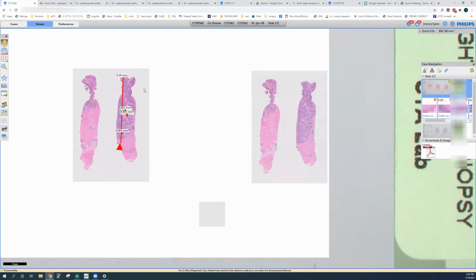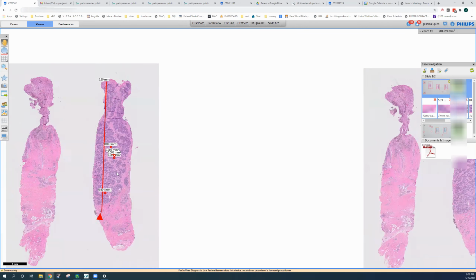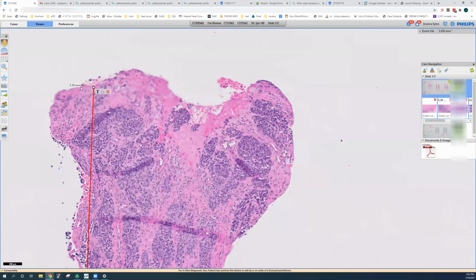And this was a non-healing ulcer biopsied by a podiatrist that was 5 centimeters in diameter on the heel of an older male patient. He actually did a 2 millimeter by 1 centimeter deep biopsy, which is why this punch biopsy looks so unusual. You can see that it's completely ulcerated. There's no epidermis left. All this pink stuff is fibrin.